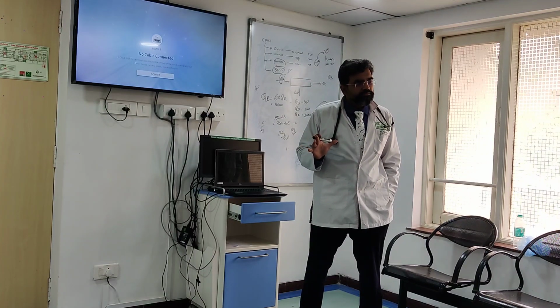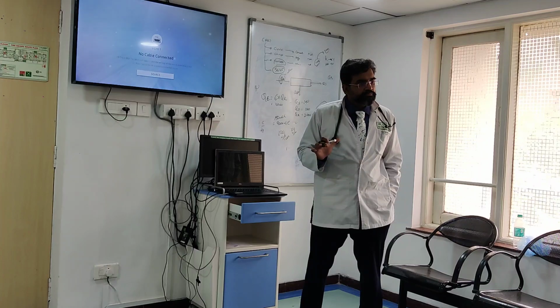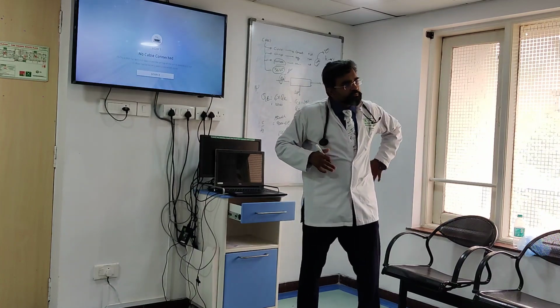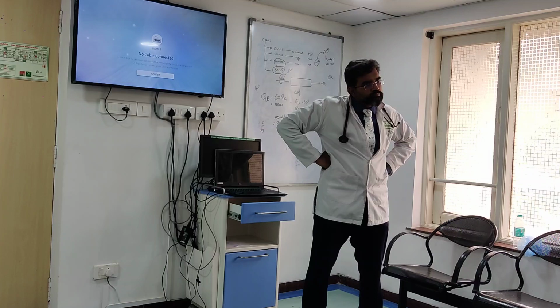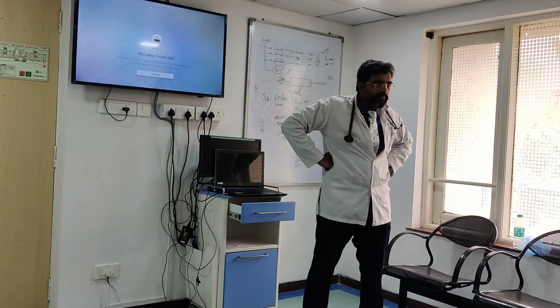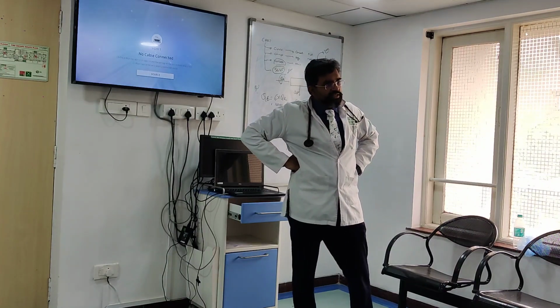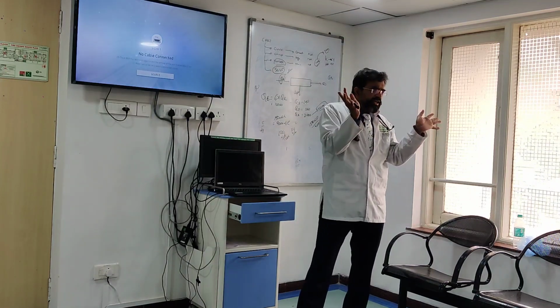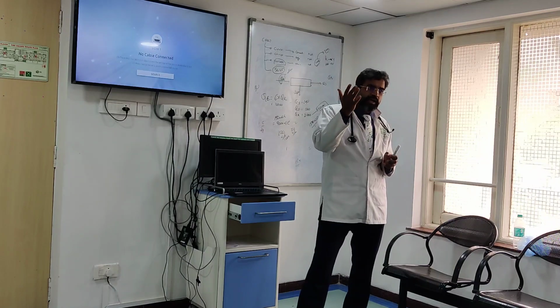So maybe proportionally the convection will remain same. If we are keeping the blood flow at 150 and just for example we are taking down the replacement fluid flow, then proportionally for the blood flow going through the pump, the convection will remain the same. Yes, it will remain the same. So instead of increasing the blood flow, we can go down a bit on replacement. We don't know exactly what happens in the micromanagement. But we know this way that if you increase the convection, the myoglobin will come out. We know that. So broadly, if I have rhabdomyolysis, I will keep my convection high, my dialysis low.